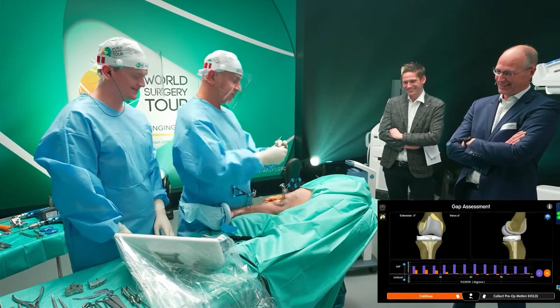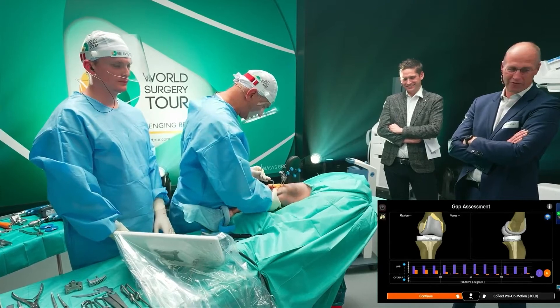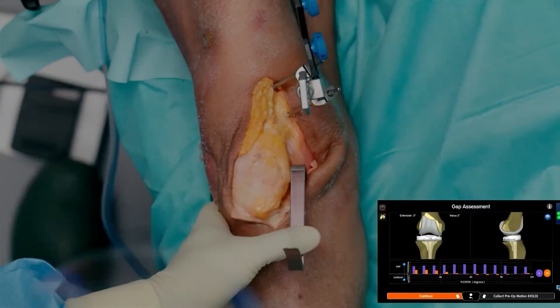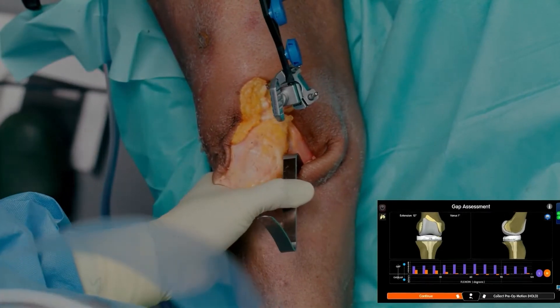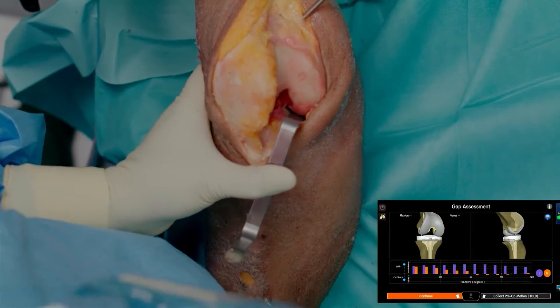So I use this tool, which is the Z-retractor. If I see tightness in any of the compartments, I would put the Z-retractor in and try to open up that compartment so I know the compliance of that compartment. You can see the medial now opens up.